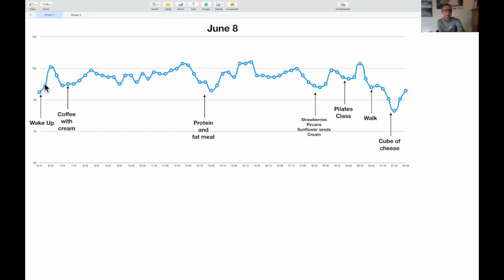I had a natural rise in the blood sugar. Of course, this is interstitial glucose that it's measuring, but we're using it as a proxy for blood sugar. So there's a rise of that, which I'm seeing as a regular pattern now. I think I saw it in the first morning's data, and I've seen it again in this morning's data.